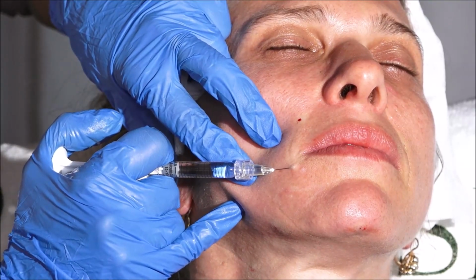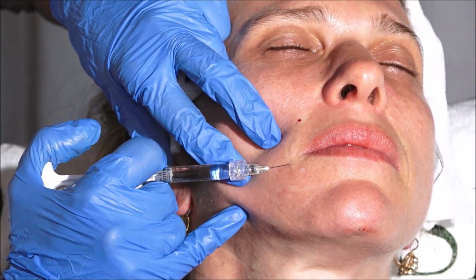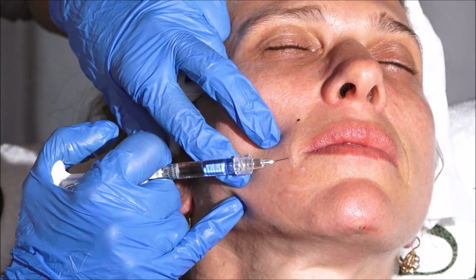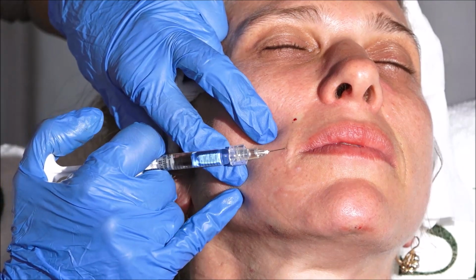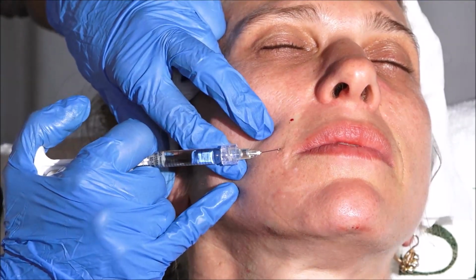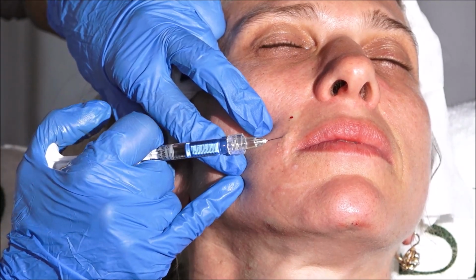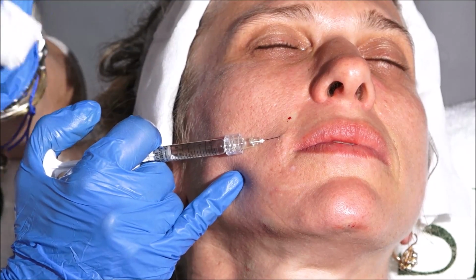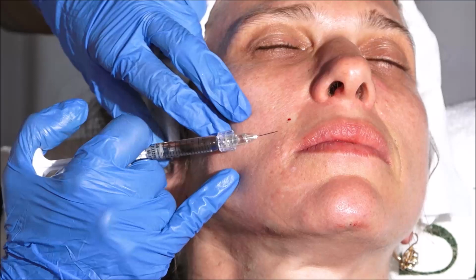You need to see this. You see the little mini bleb. Otherwise, you're not intradermal enough, or you're not intradermal at all. And when you stop seeing the papule growing, stop injecting, because the product grows to the subcutaneous.